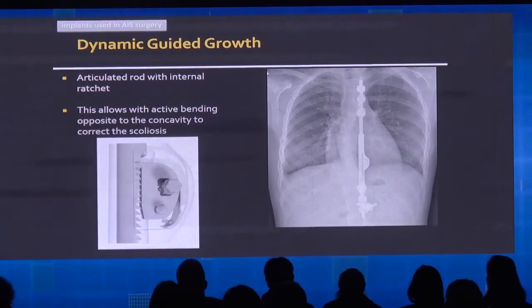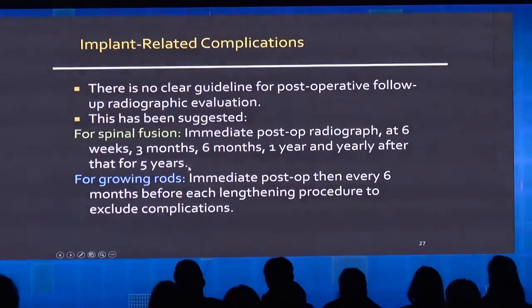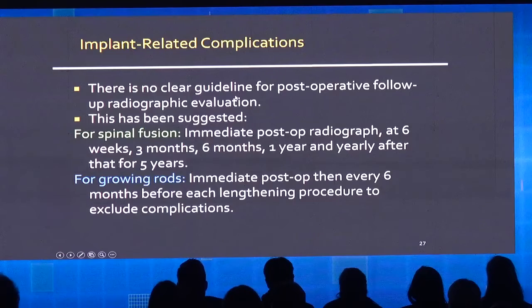There is no need for re-surgery, and it corrects the scoliosis. There is one caveat that you will see later on. Okay, now we are going to speak about complications. I think that I've reviewed almost everything in terms of implants.